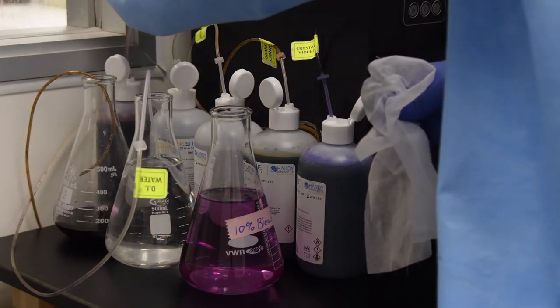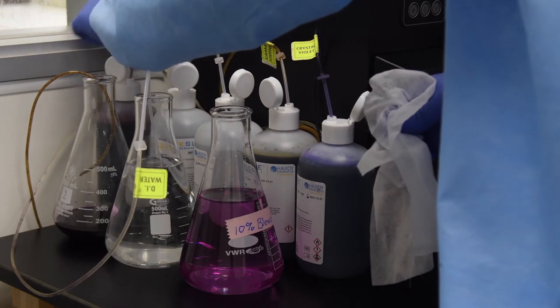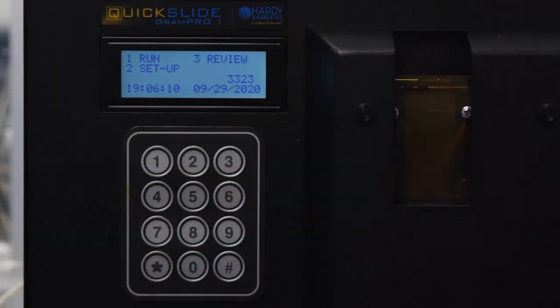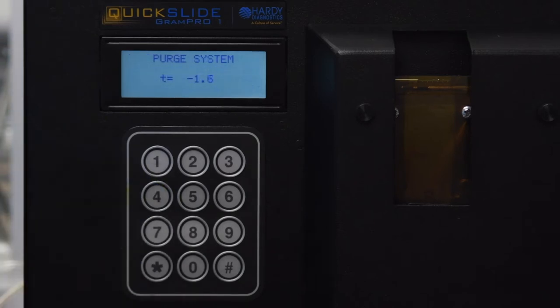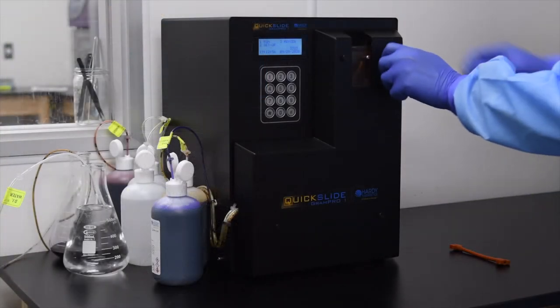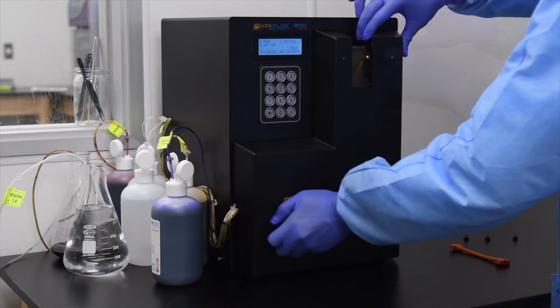Before beginning the process, install the new kit bottles onto the Gram Pro 1. From the home menu, press 1 to select Run, press 4 to select Purge. Remove the front pump cover by unscrewing the four thumb screws on the face of the Gram Pro 1.